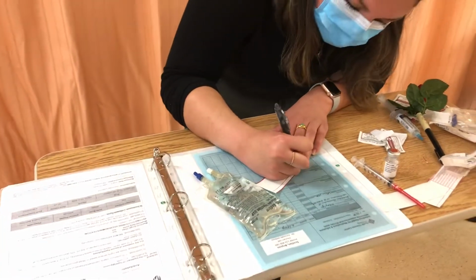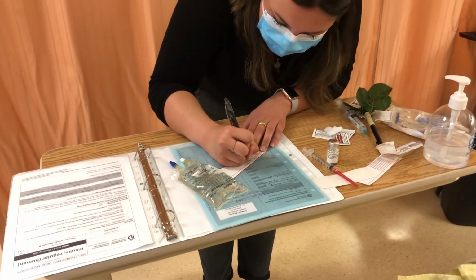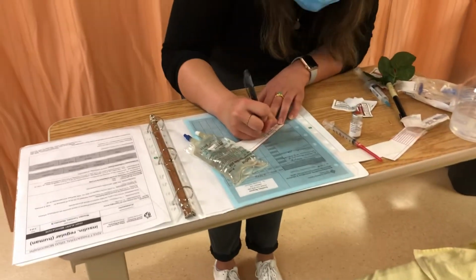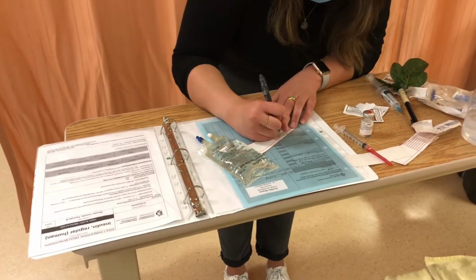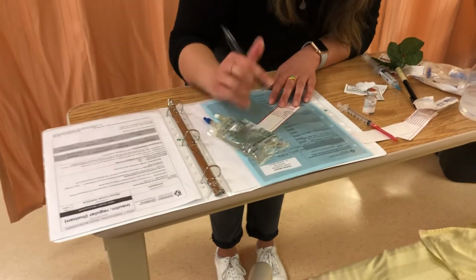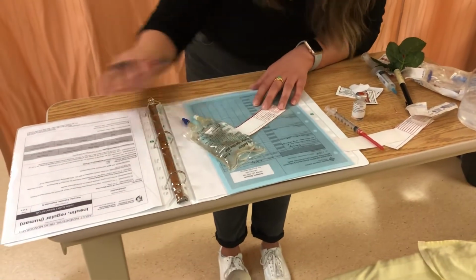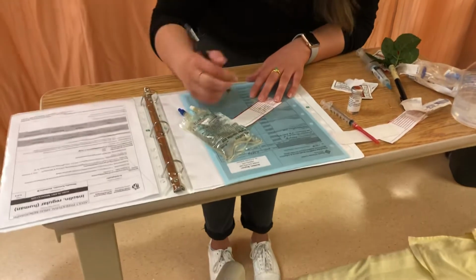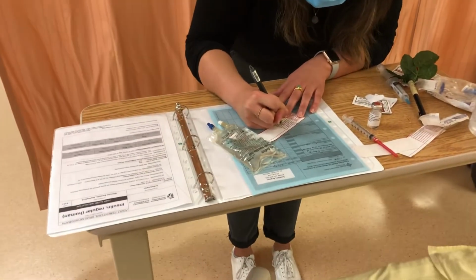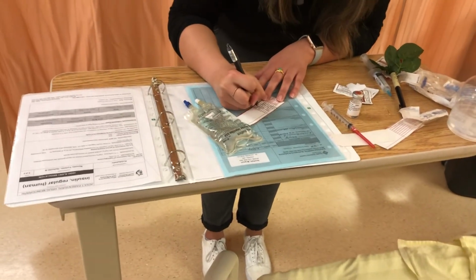So we've got BS, insulin R. The dose is 100 units, and I've confirmed this with my vial. The volume is 1 milliliter of drug. The diluent is 100 mLs of normal saline. The concentration is 0.99 units per milliliter, as I confirmed on my PDM. The date and time is today, and it is due now.